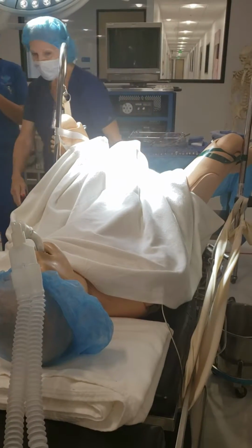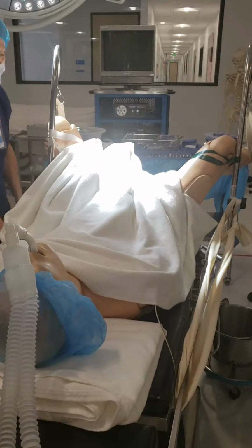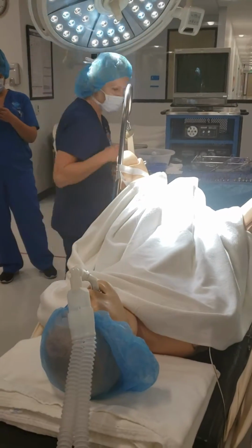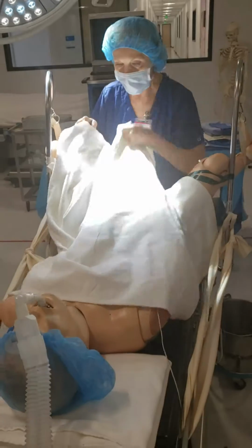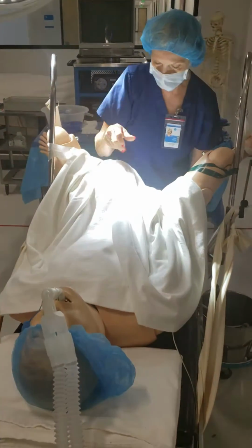You see, there's a break in the table here. So we have to really watch their arms and hands when the table is going to come back up. That's something you have to think about as well. Okay, the patient is always kept covered until you're ready to go.